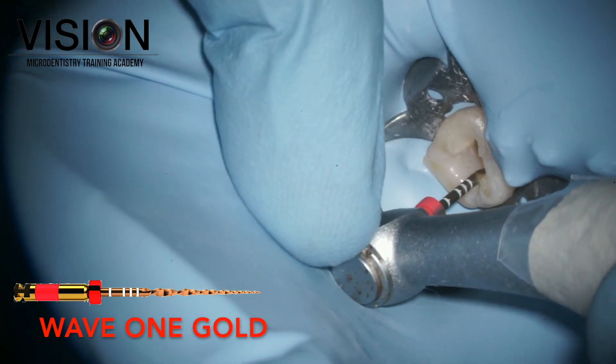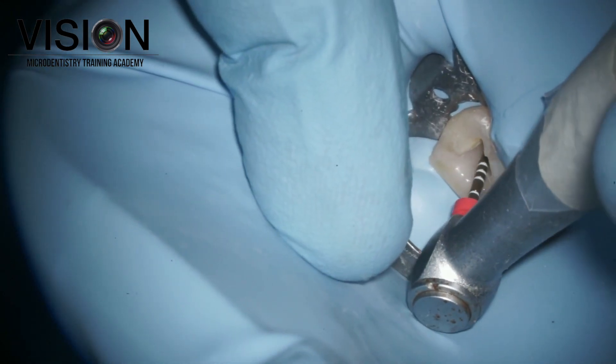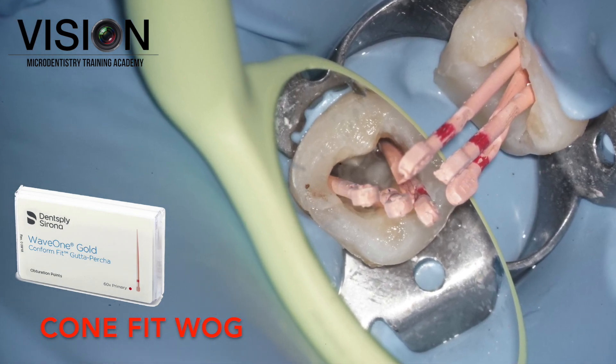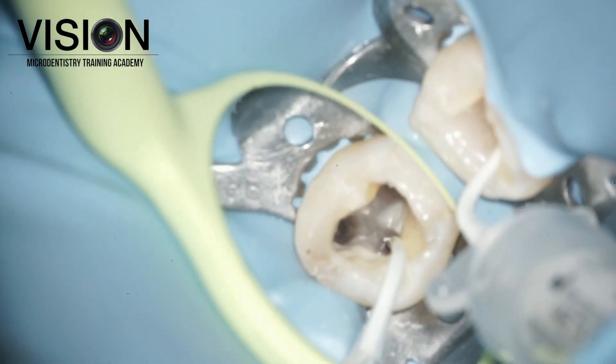Once that was done, we could manage to get a glide path very easily and we rapidly shaped the canals using Wave One Gold. That's a single-file reciprocating handpiece, and a single file was used to complete the entire canal preparation — all three canals.